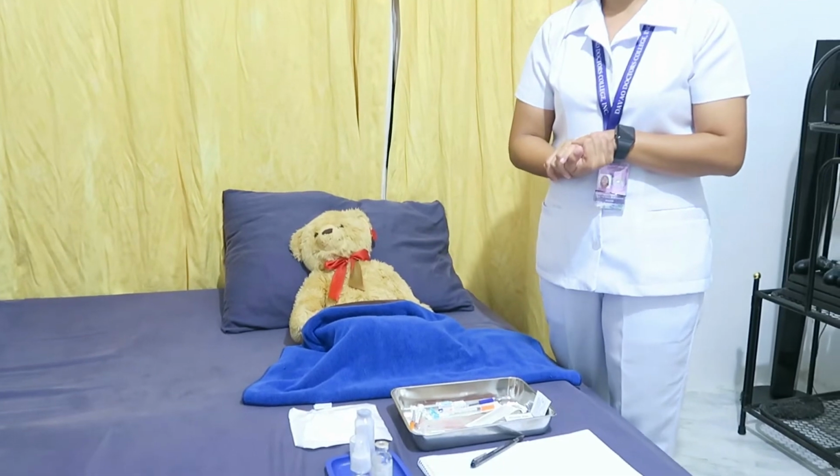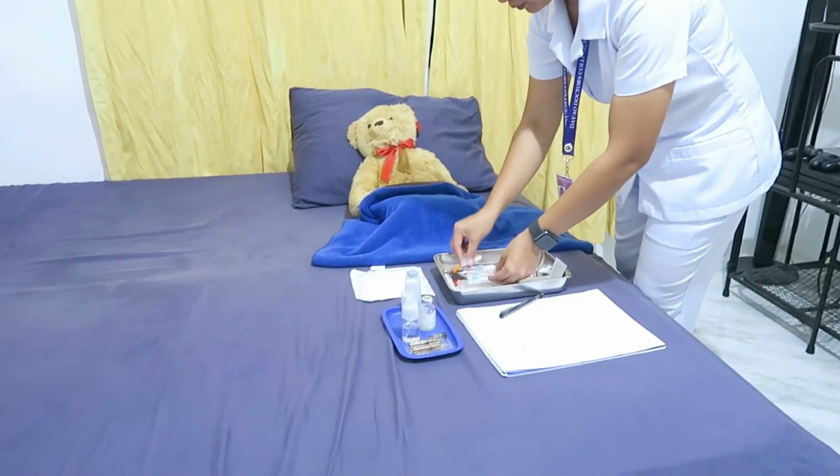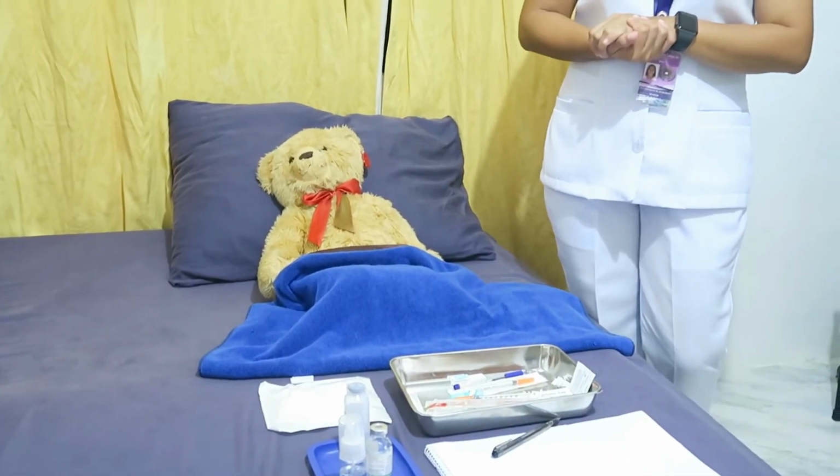So, the next procedure is to dispose of supplies appropriately. The rationale for that is that proper receptacles are used to prevent others from being pricked with the needle and syringe. Let's proceed to the next procedure.